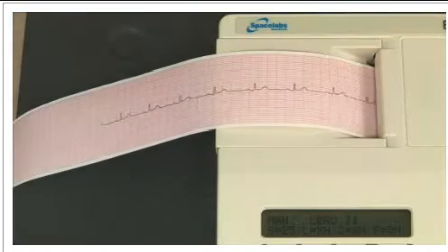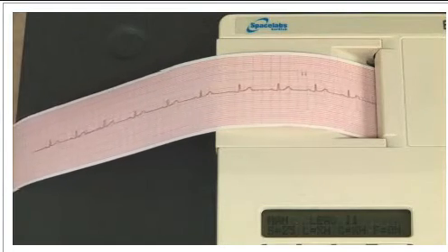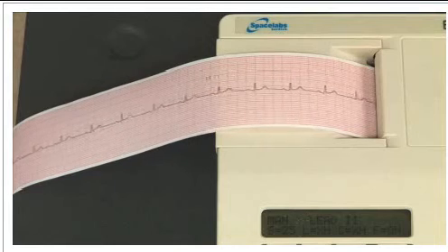So I'm going to give you a little overview of this. This is going to give you an idea, but it's a lot cooler when you experience the things in real life. And enjoy this video. This video will demonstrate the collection and appearance of an authentic ECG.